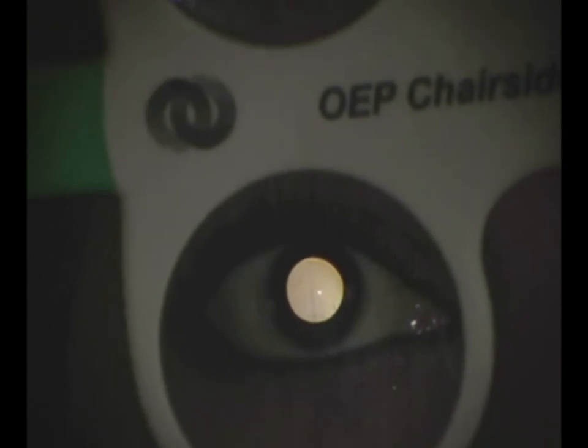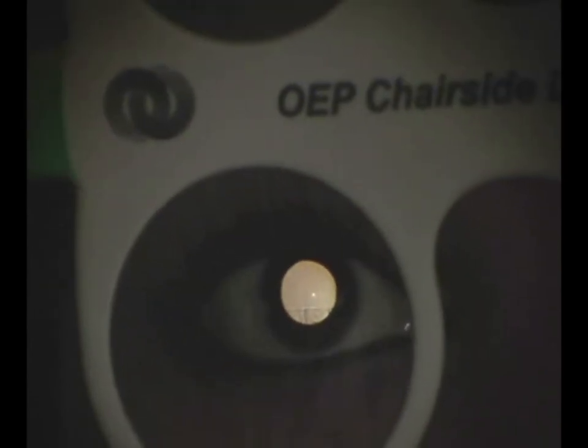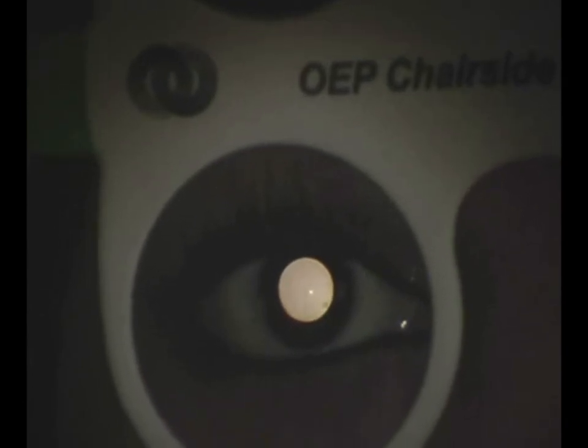We'll do the ones first. Here's the ball. Okay. Good. We're aligned. And plus ones. In. Plus one. Out. Plus one in. Plus one out. Blink, blink, blink. Trying out a little. Plus one in. Plus one out.